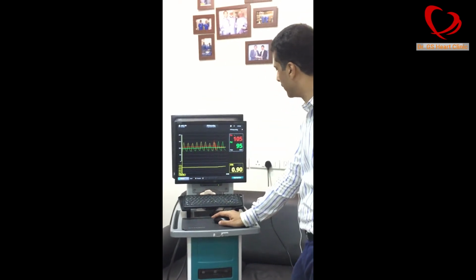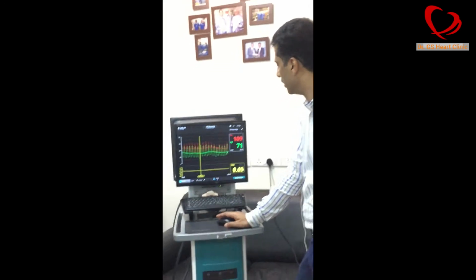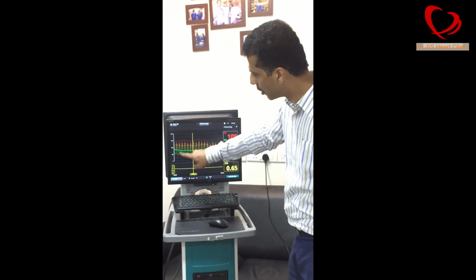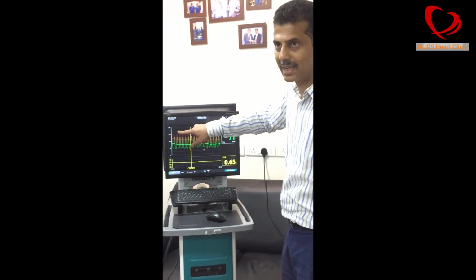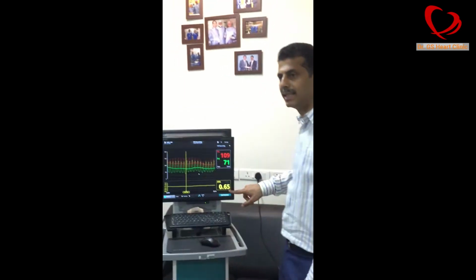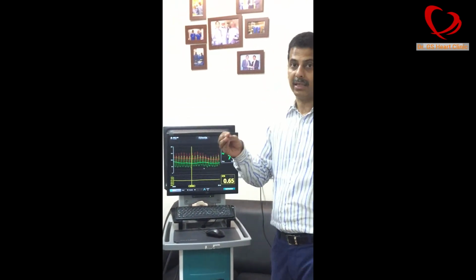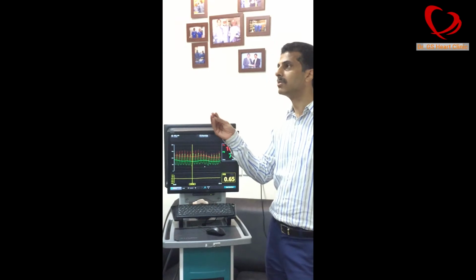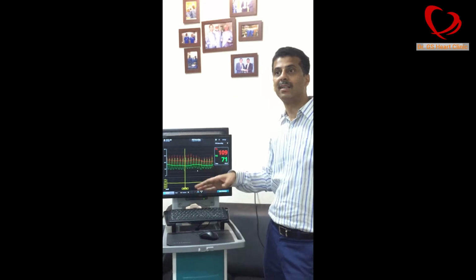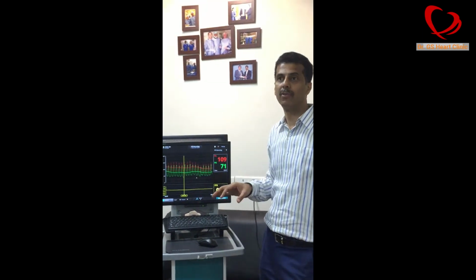So we just did that and we reviewed again. And this is the FFR with the adenosine. Once we give adenosine, you can see the green pressure drops very much compared to the red line, which is a difference that gives an FFR of 0.65. Anything below 0.8 is highly significant. Generally, 0.65 is really significant. We see sometimes 0.75, 0.79. It's all really borderline. But here, very clear cut, and it's very strong evidence that there is a large amount of heart muscle which is not having good blood flow.